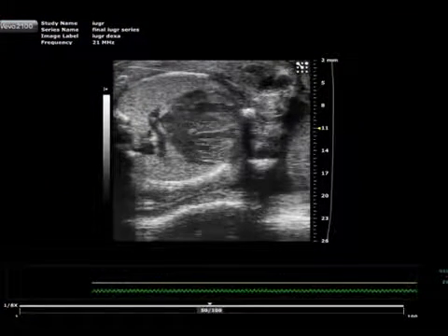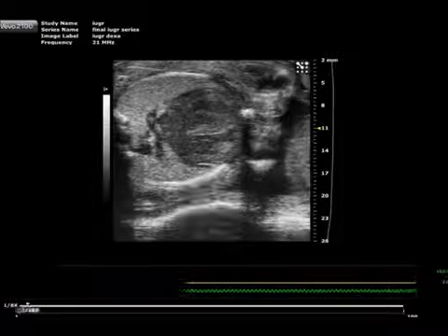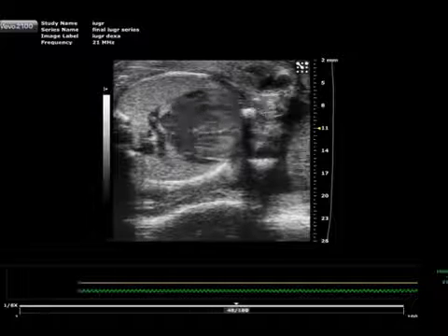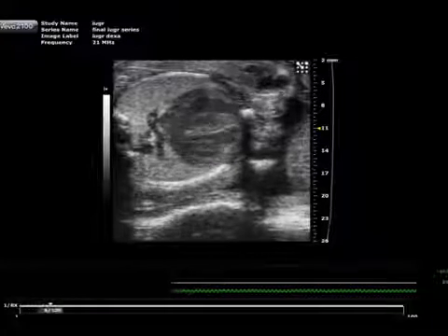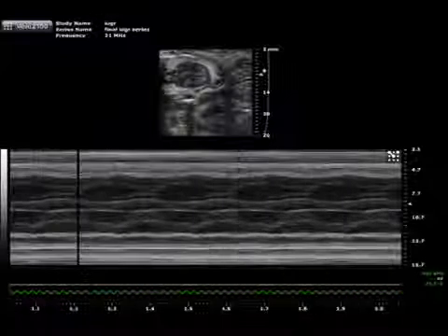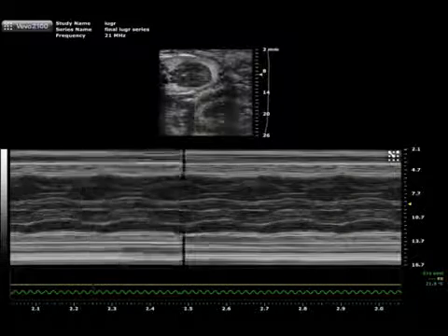Working in a systematic and efficient manner at the level of the lateral 4-chamber view, record a B-mode cineloop of at least 5 cardiac cycles to determine strain, strain rate, velocity, and displacement. Then, still working in this standard view, obtain M-mode echocardiography indices.